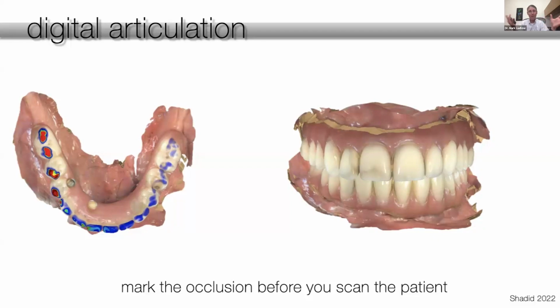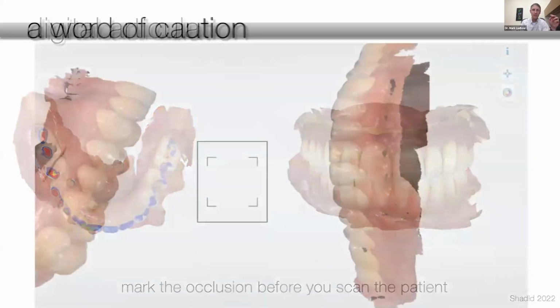And if they're off, well, then you've got a problem. You've got to figure out whether your marks were wrong or whether, again, your scan was wrong. But that is one of the best things. It's so simple. Just put the articulating paper and tap, tap, tap, tap, tap, and then make sure the heat map matches up. I love this, especially for my big cases like we see here, because I've never had the occlusion come in so well on these types of cases due to being able to verify it before the patient actually leaves.